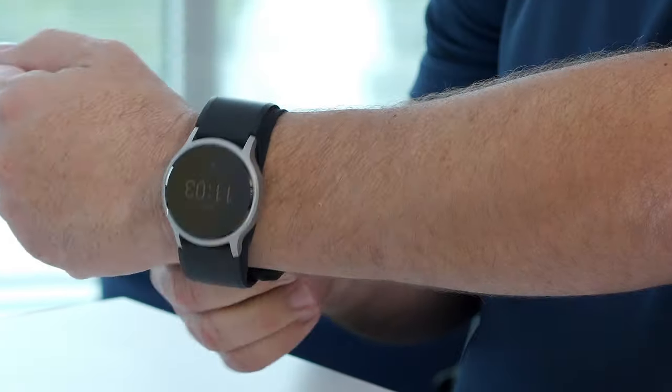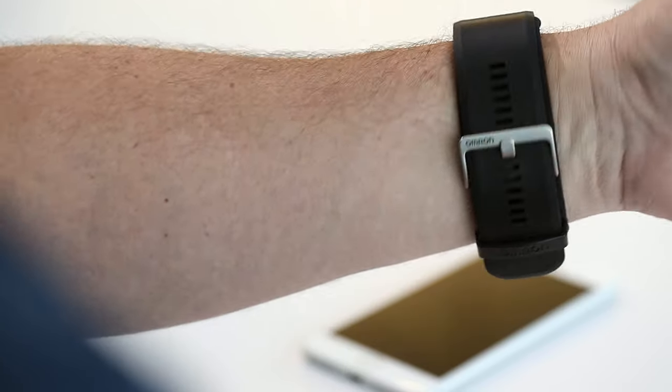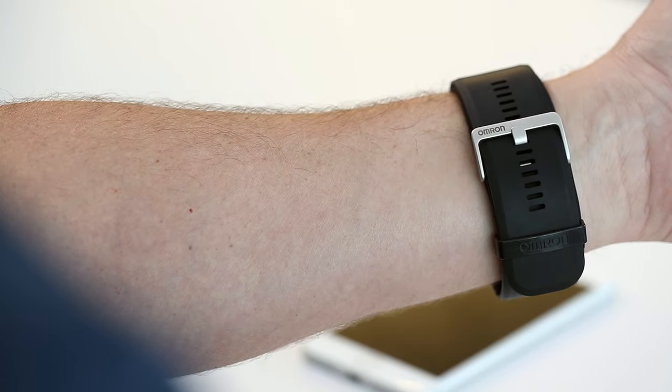Step 2: In order to secure an accurate measurement, adjust the band so it fits comfortably yet firmly around the wrist. As a good gauge of fit, you should not be able to insert your index finger beneath the band.